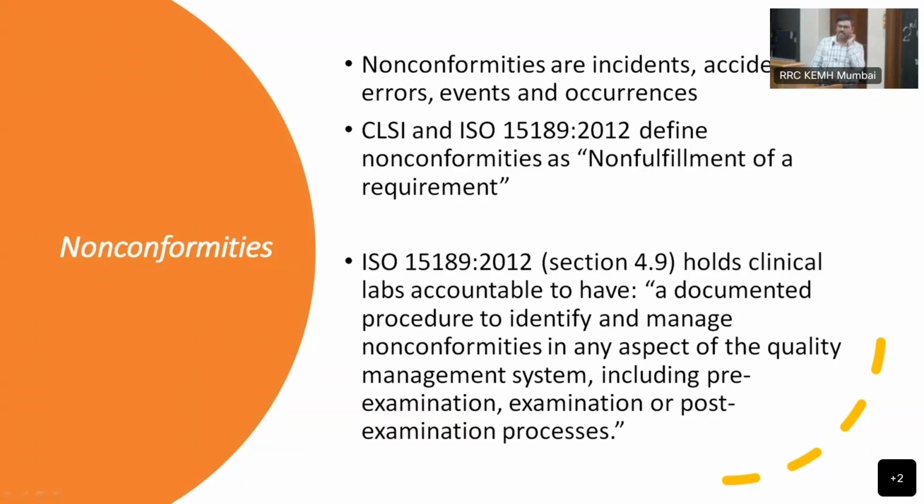I have just done the comparison with the previous standard. All the assessors, as well as the conformity assessment bodies, meaning labs, are asked for their opinion on whether changes are required or suggested.